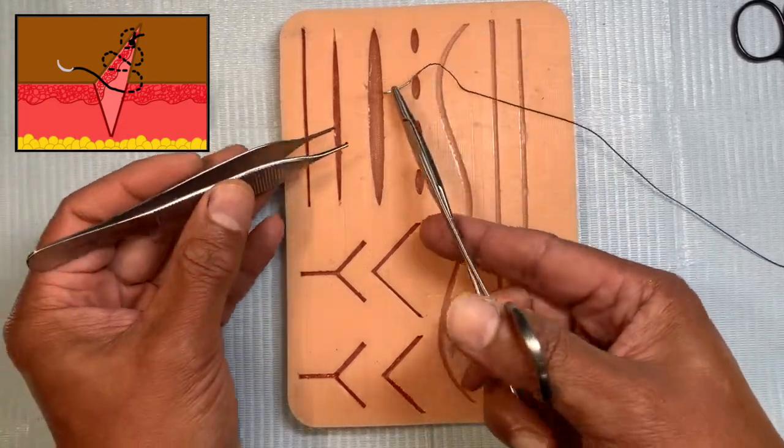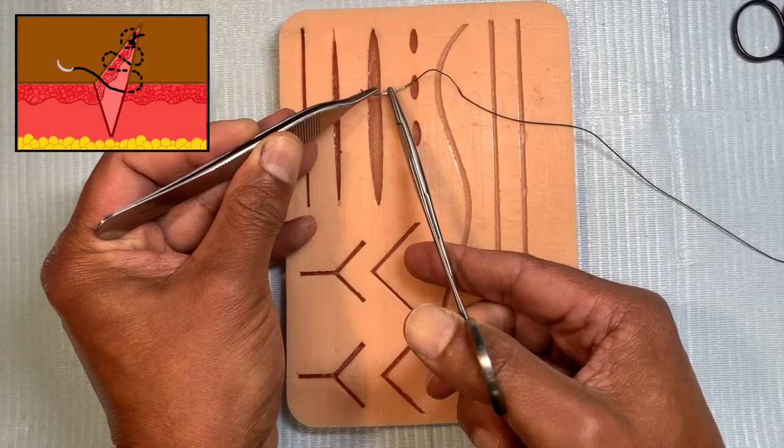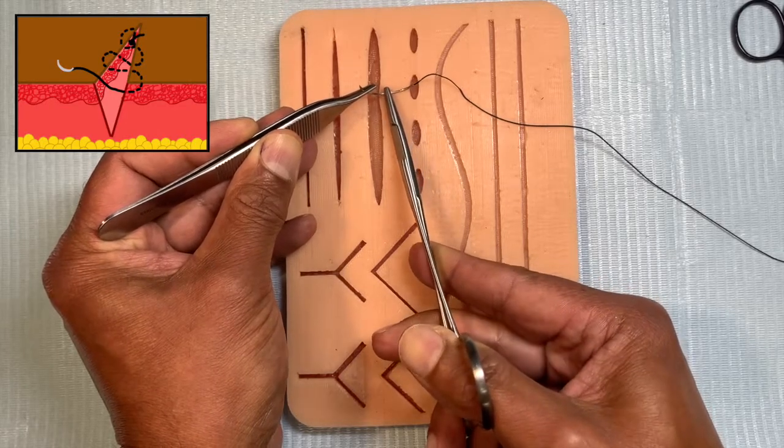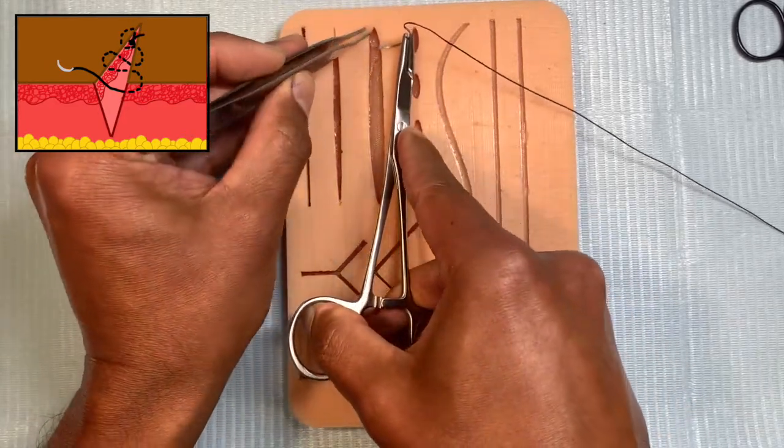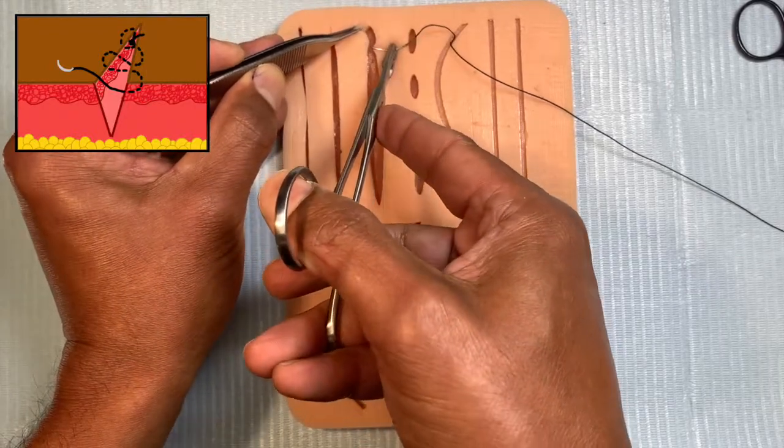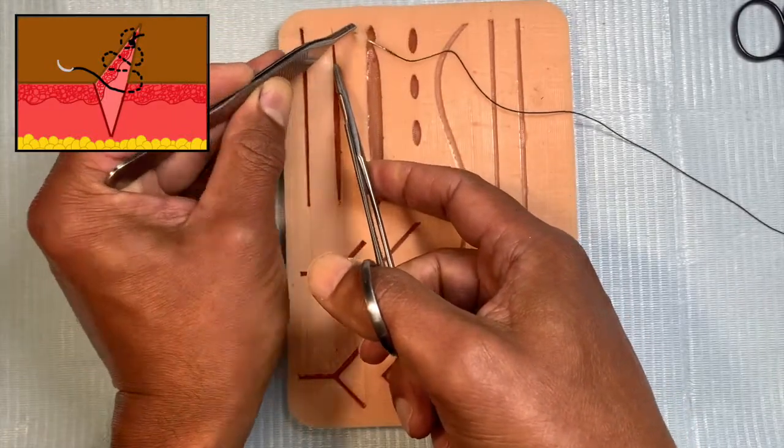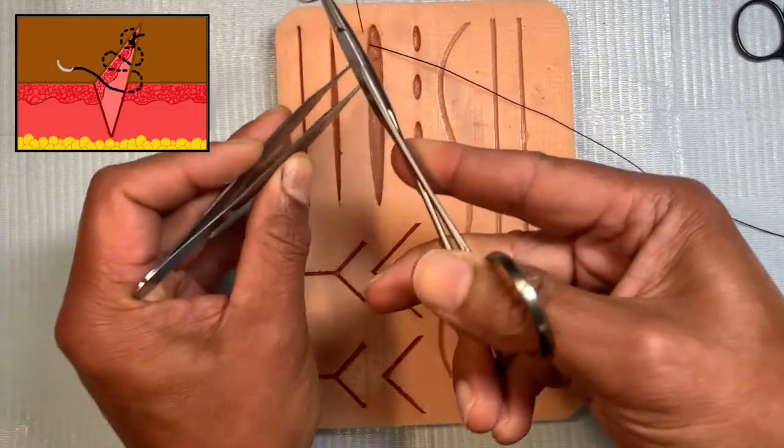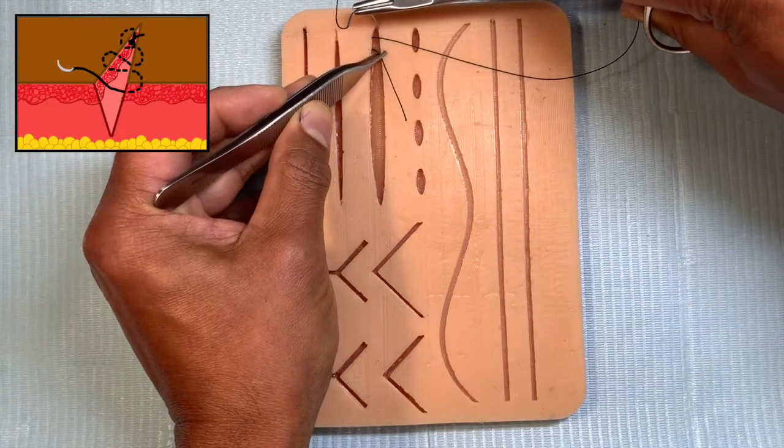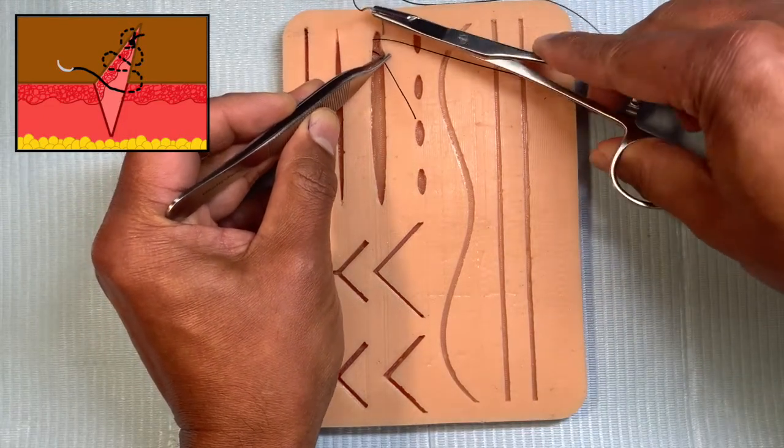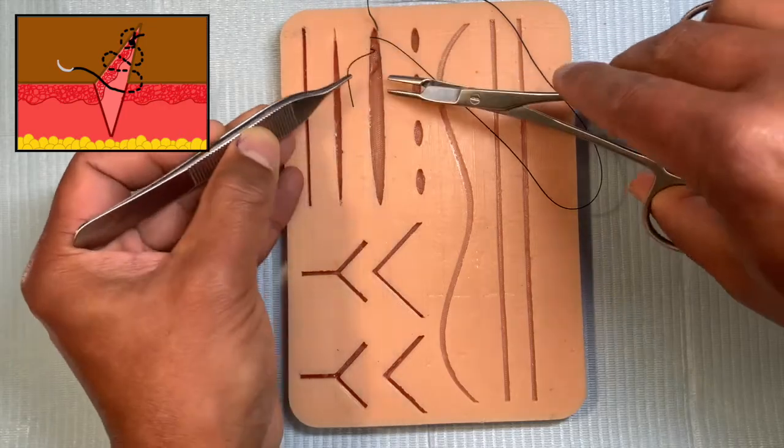The way the suture is done: make sure you're holding the needle virtually from the middle because you're going to take a stability knot to start off the suture. Here you use a deep dermal situation where you do deep to surface. Take the stitch out, then go surface to deep. This first bite keeps everything together.